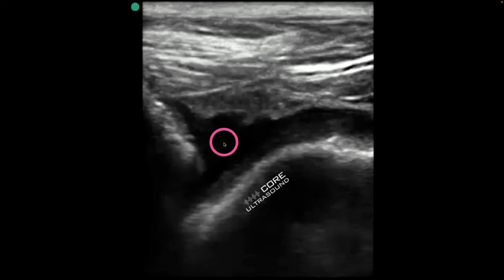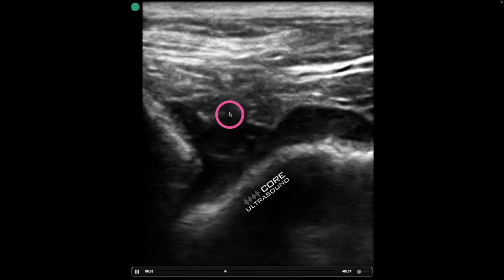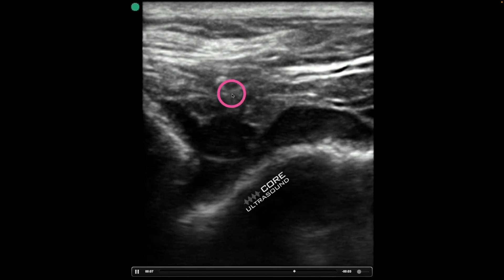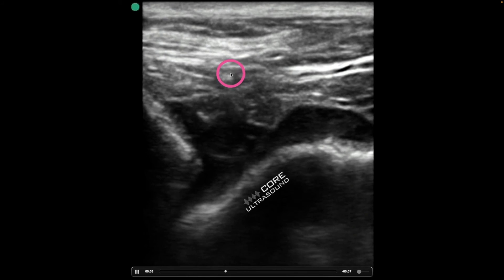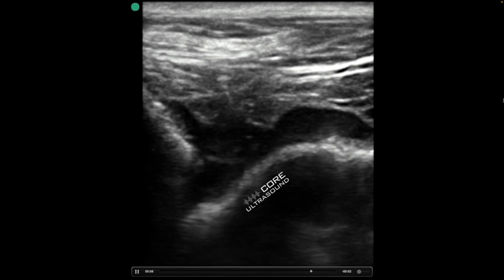This is an ankle joint — this is cephalad, this is caudad. This is an example of performing this way out-of-plane technique. I'm relatively midline here; I don't have great needle visualization, but I can see some tissue movement and some hyperechoic material. I know I'm going straight down, and I go ahead and aspirate.